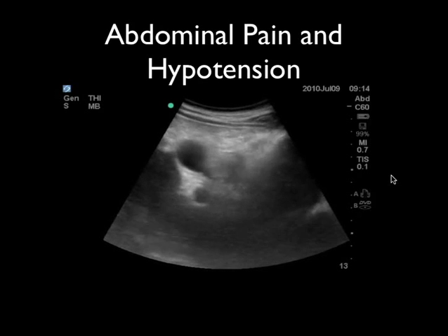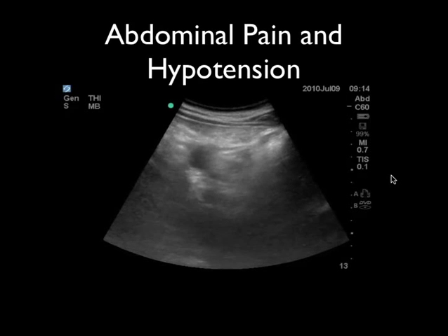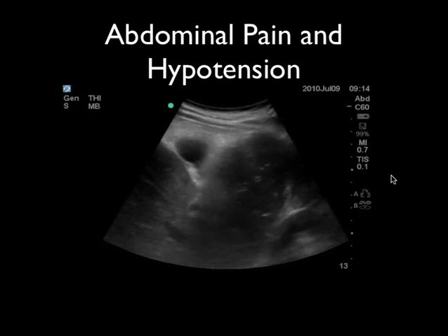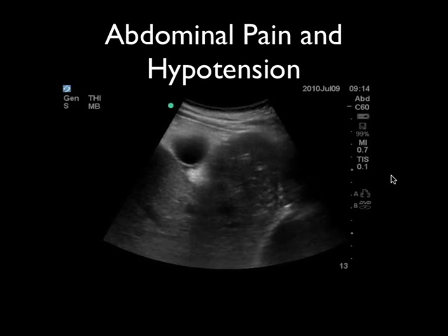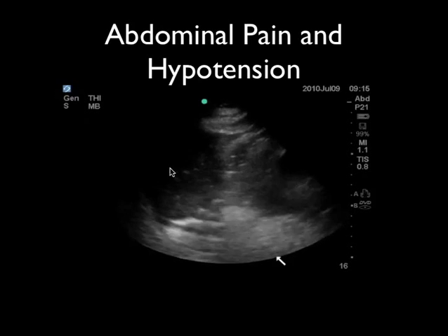little bit better history, when we controlled his symptoms, yeah, maybe he was a little bit more short of breath than he had abdominal pain. What started out as abdominal pain turned out to really be more shortness of breath, and that's just the nature of emergency medicine. We only have so much data, but certainly here's that liver over here.